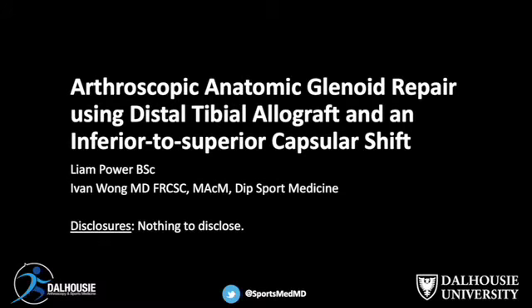This is a technique video describing an arthroscopic anatomic glenoid repair using distal tibial allograft with an inferior to superior capsular shift, addressing recurrent anterior shoulder instability following traumatic dislocation in the presence of capsular laxity.